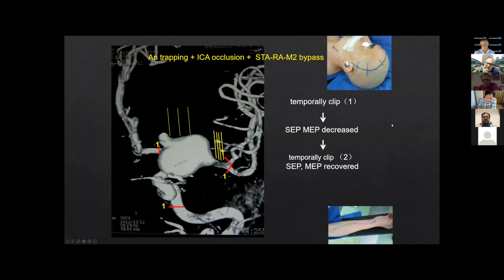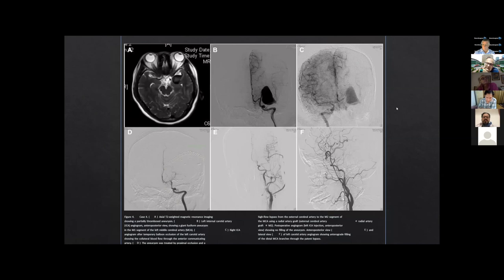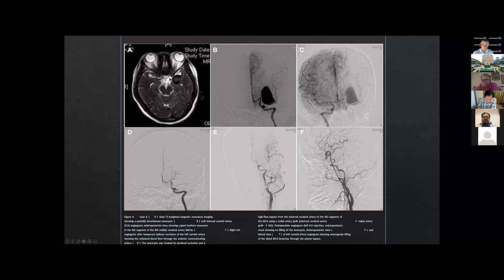This is another case — a more distal M1 segment giant aneurysm. We performed proximal occlusion combined with a distal STA-ECA radial artery to MCA bypass. We can see the radial artery was patent and blood flow came to the M2 segment, replacing the whole MCA territory.